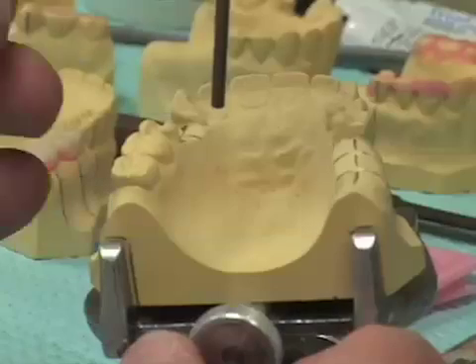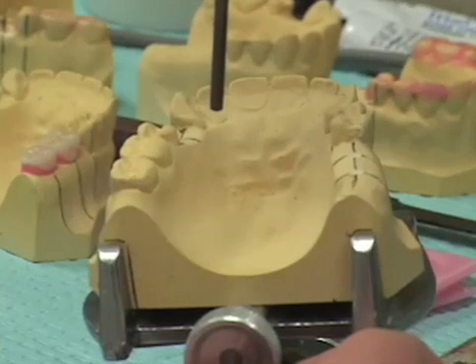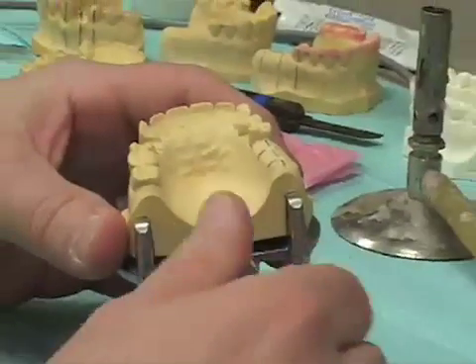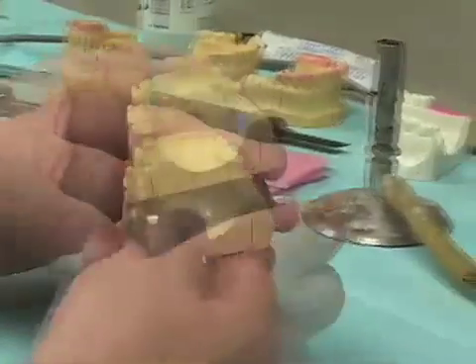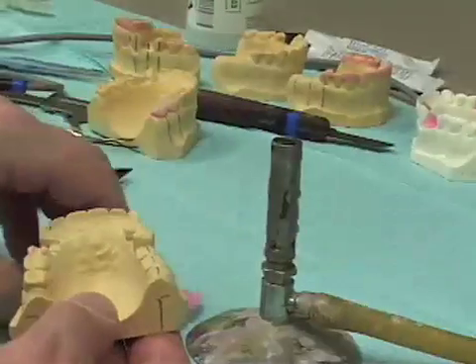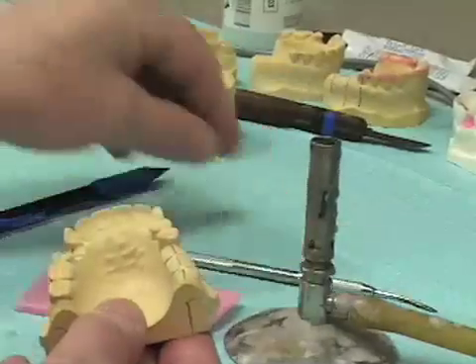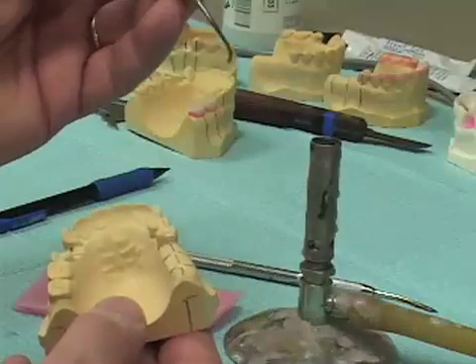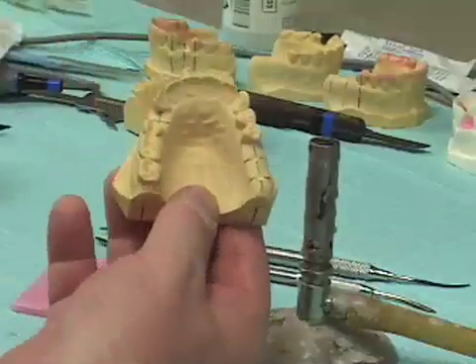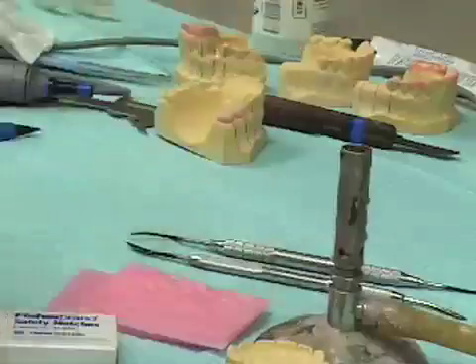My next task will be to block this cast out with pink baseplate wax. I'm going to remove my cast from the surveyor table and bring in my Bunsen burner, some pink baseplate wax, a number seven wax spatula, and a large Peter K. Thomas instrument to perform the blockout for this cast. I'll now light the Bunsen burner and begin the blockout process.